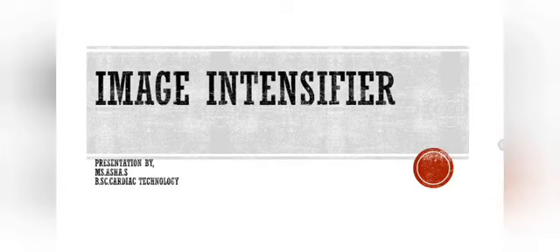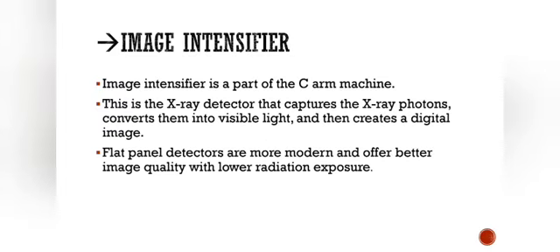Hello everyone. Today's presentation is about the topic image intensifier. Image intensifier is a part of the C-arm machine. C-arm machine is nothing but the machine that we usually use in the cath lab.